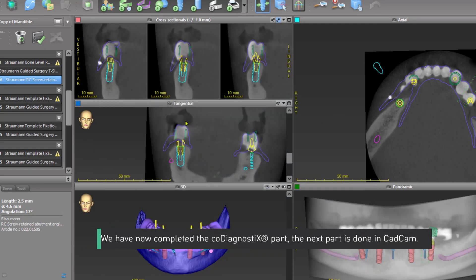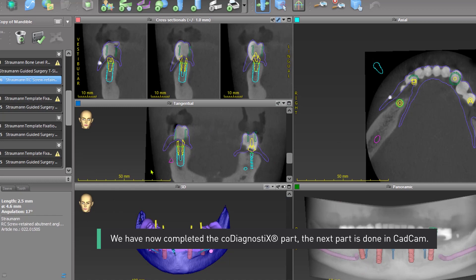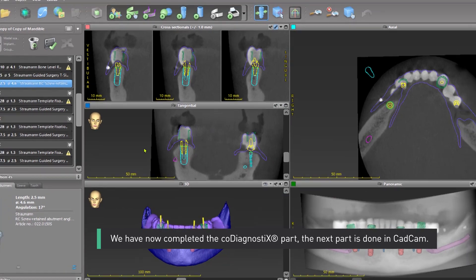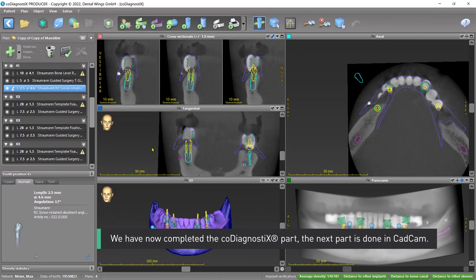We have now completed the co-diagnostics part. The next part is done in CAD-CAM.